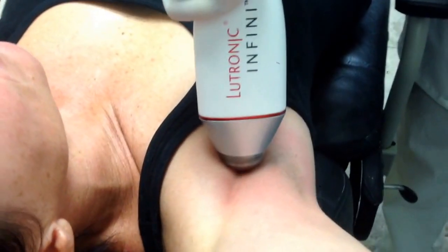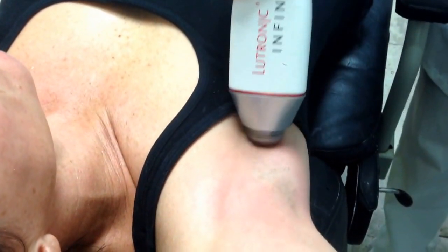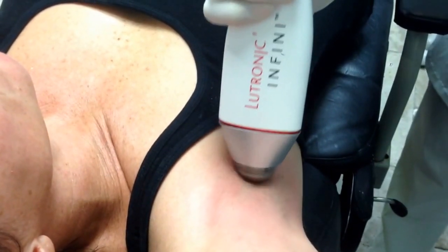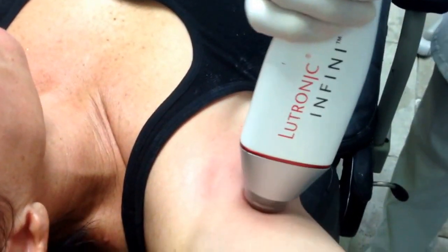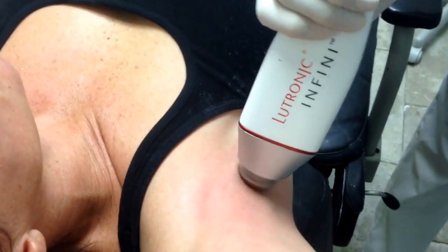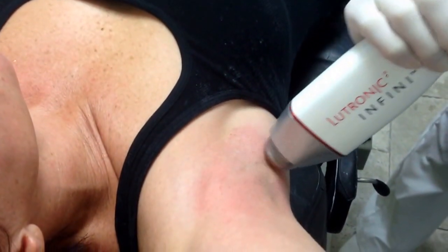What we're being shown here is using the Infini to treat hyperhidrosis, or sweating. What we do is we first measure the level of the dermis, how thick it is, and we know that the sweat glands are at the deepest level of the dermis or just below it. So we treat at the level of the junction of the sub-Q and the dermis, and then a little bit above that.